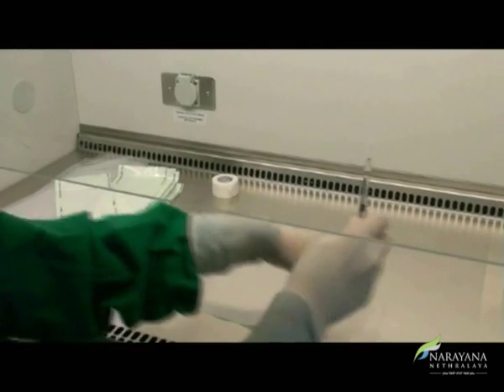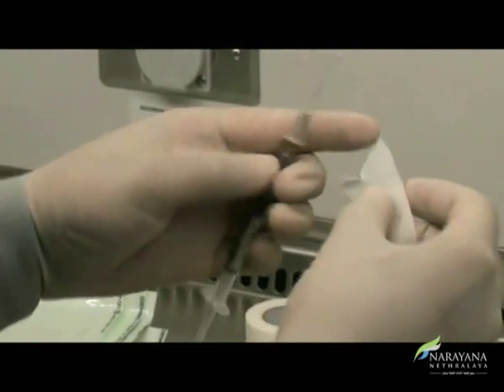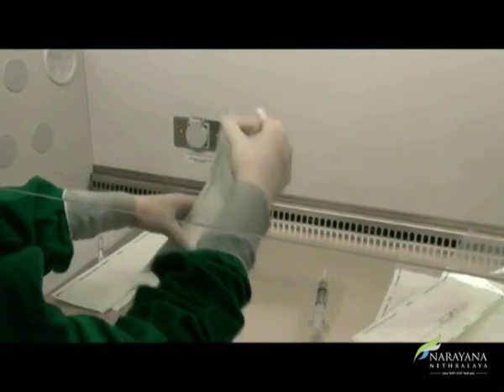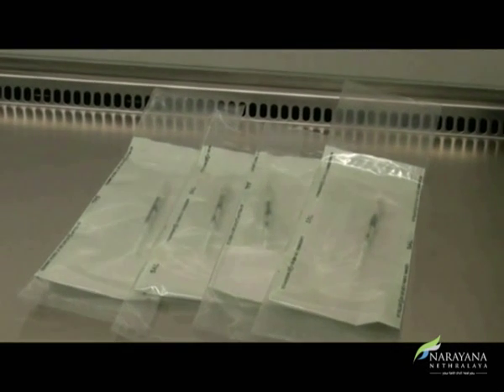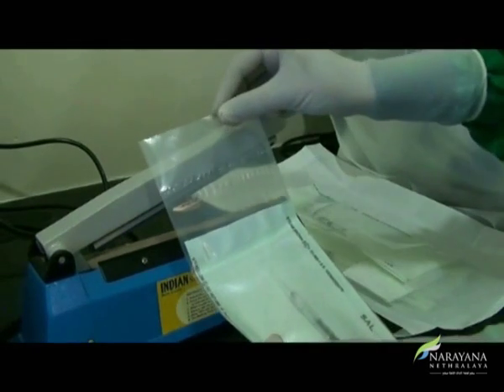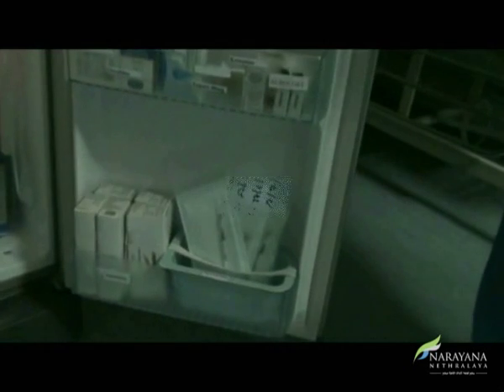These syringes are then capped by placing needles and taped with a sterile tape. The last syringe of the same vial is sent for culture. Packaging is done using a dual pack — the inside one being a paper pack, which is again placed in a poly bag. The paper bag is the same as used for ETO sterilization. After this dual packing it is sealed, with the seal placed double to ensure sterility. Preparation of multiple pre-loaded syringes of Avastin ends with proper storage between 2 to 8 degrees centigrade in the refrigerator. All packs should be labelled and stored in the door of the refrigerator, which has well-monitored temperature control.